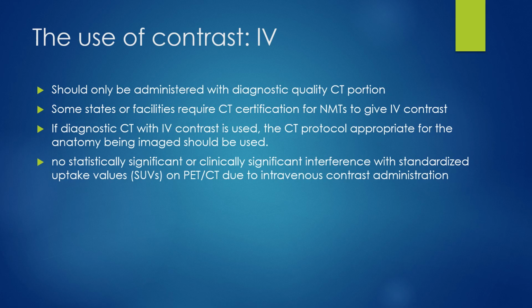Some facilities, even though the states allow it, will still require the person to be CT certified in order to administer IV contrast or do the higher dose diagnostic quality CT. That can be done pretty much on any PET CT scanner. It's better if it's a larger slice, like 32, 64, or even 128 slice CT, depending on what you're using it for. And then, of course, even if you're CT certified, you still need to be trained in how to give IV contrast and recognize contrast reactions.